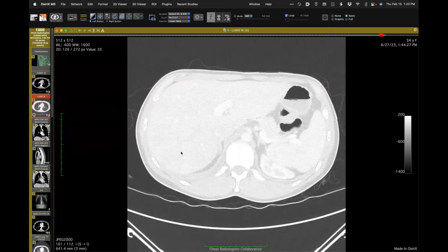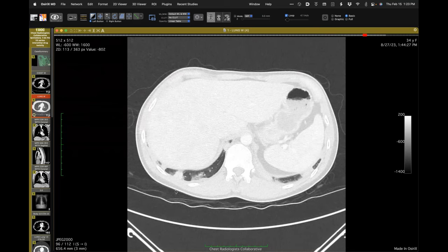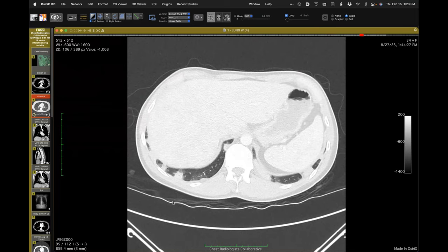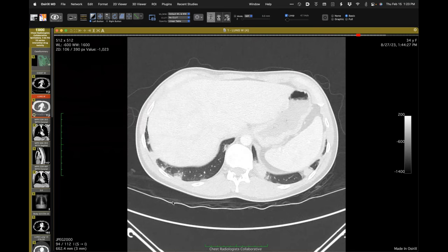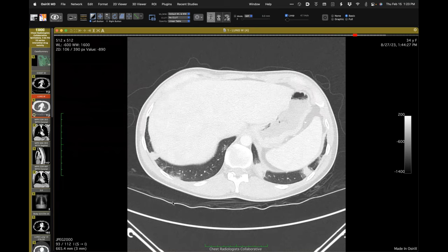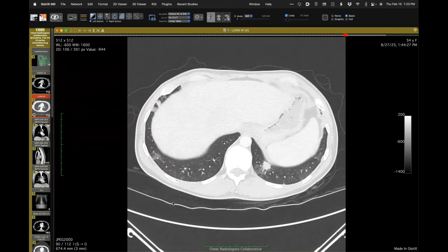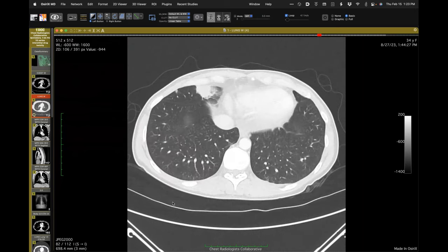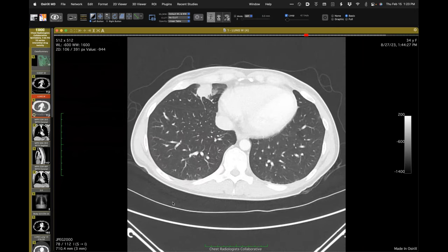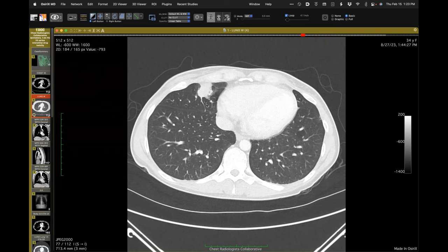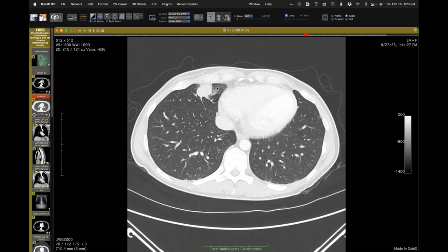This is what the CT looks like: opacities in the lower lungs — circumscribed, multiple, subpleural, spherical. The largest one is in the right middle lobe, with slightly lobulating margins and adjacent lung ground-glass attenuation next to it. That's from August.